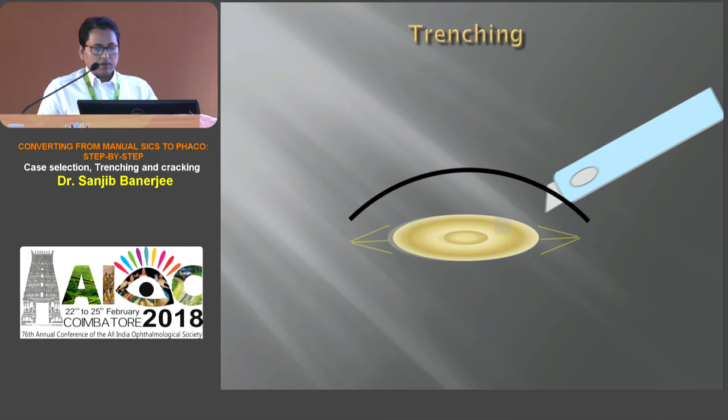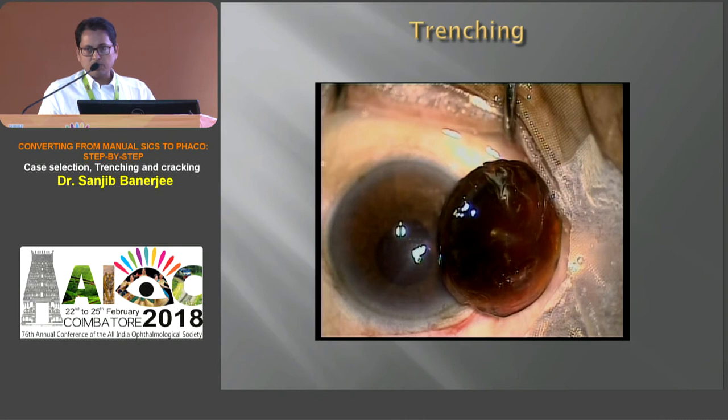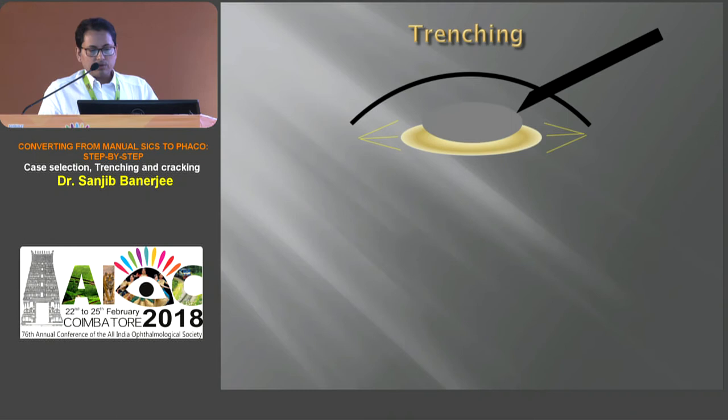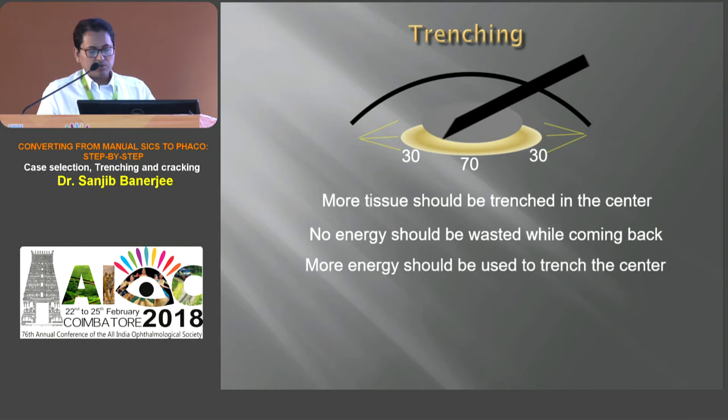One third of the tip should be buried in the nucleus to get perfect trenching. If we bury the tip too much, it doesn't trench but pushes the nucleus to the periphery. The same thing happens if we use less energy or are shy on the paddle. The nucleus is thicker in the center, so while trenching more tissue should be trenched in the center, and while coming back no energy should be wasted. More energy should be used during trenching in the center of the nucleus. Every time, refocusing the microscope is essential to see the posterior aspect of the nucleus clearly.